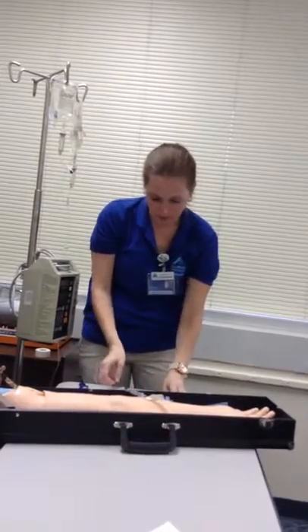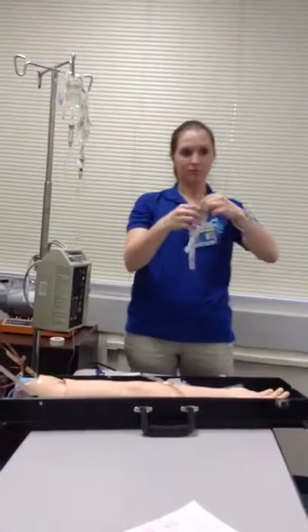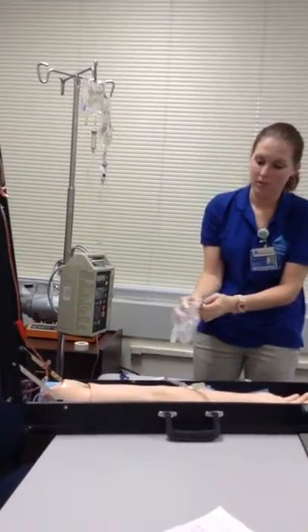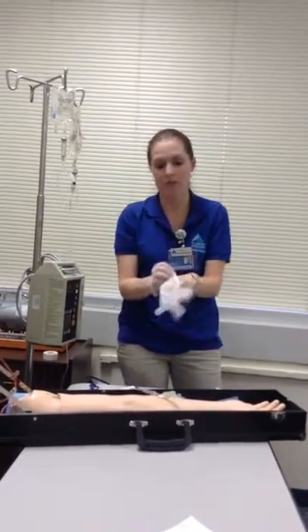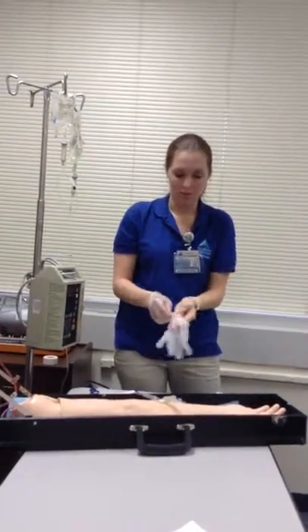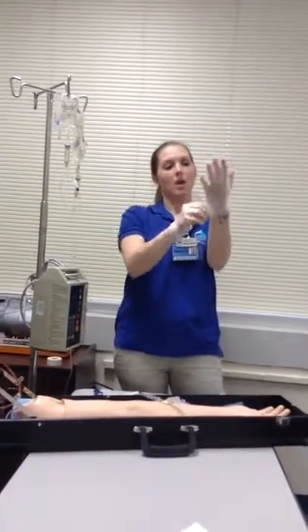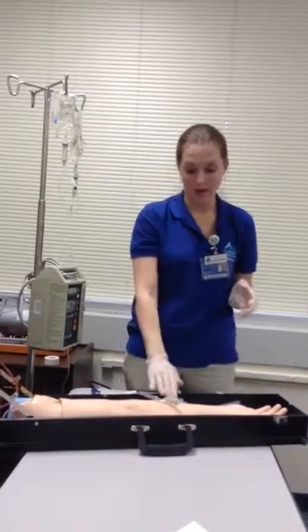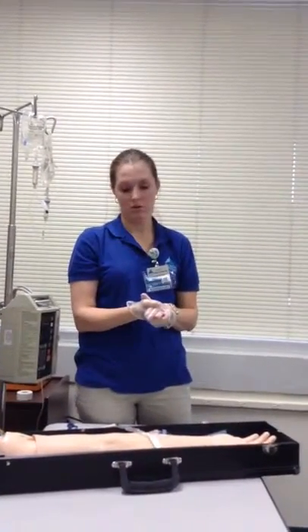All right, so now we're going to go into the patient's room. I'm going to clean my hands, and I'm going to go ahead and glove. Once I've gloved, I'm going to talk to my patient again and let her know what's going on. Miss Jones, I have an order here for you to get some Flagyl for your peptic ulcers. Have you had any allergies, or have you had this medication before? I have no allergies, and yes, I've had this medication before.